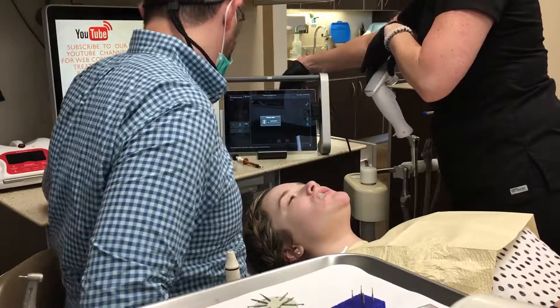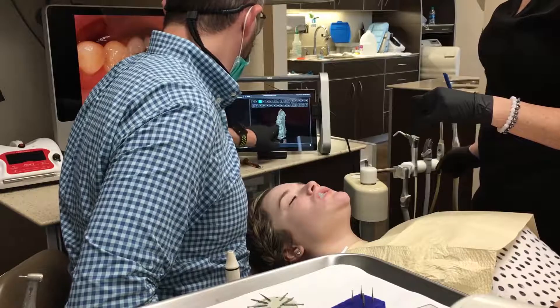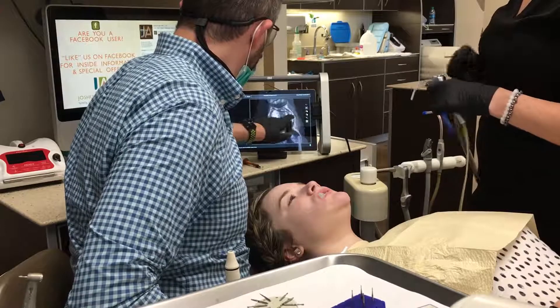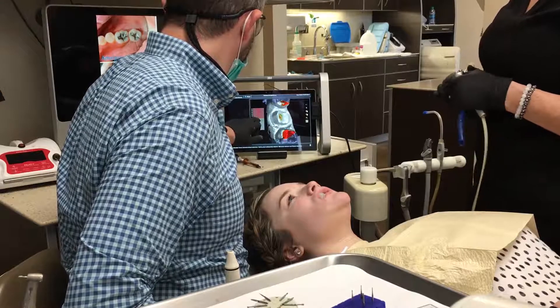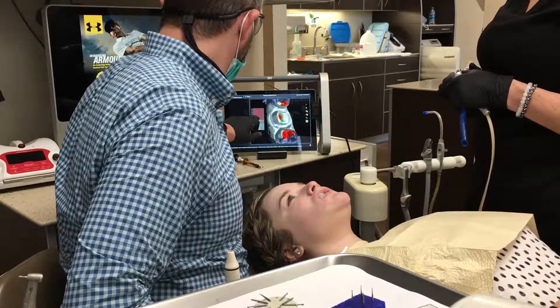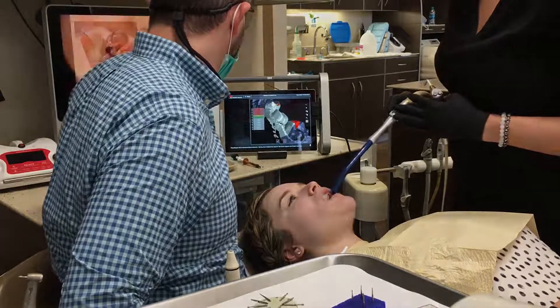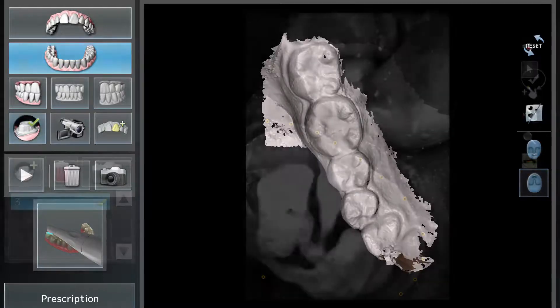Now we're going to save these scans and I'm going to start taking a look at the preparation itself. I'm going to tag the preparation — tell the computer where the preparation is. Then I'm going to take a look at the finish line and make sure everything's captured in the detail I want. We're really just pulling out still images from the video itself, and this is how I can really look and make sure we got the finish line. I can check that we got the occlusal reduction we need. The filters are set at 1.5 millimeters, so that little dotted green you see is 1.5 millimeters of reduction. In that one spot we have 1.5 millimeters; everywhere else we have more. We got a really good scan here with the 3M True Definition — it took me under five minutes to do the operative quadrant, the opposing quadrant, and get a good bite registration.